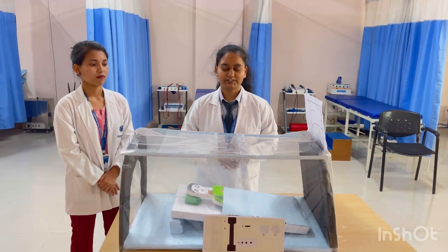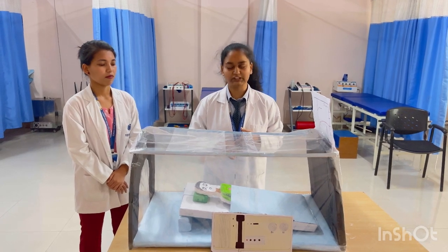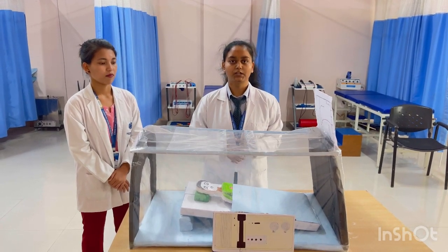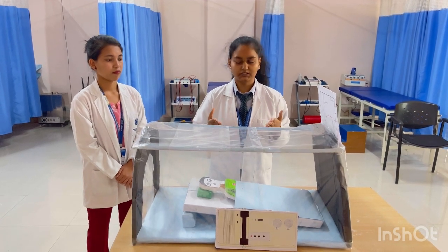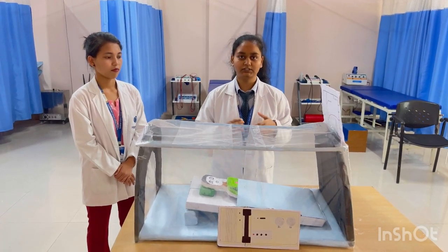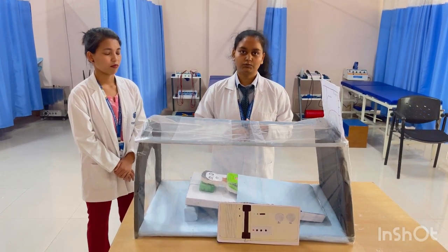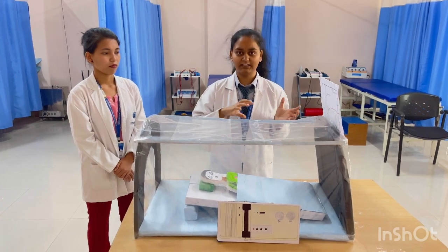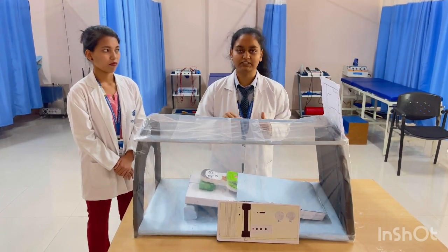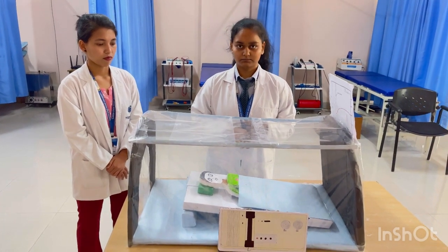We will also do auscultation of the patient to see if the cardiopulmonary situation is good. If it is not good, there will be a risk of some side effects if the patient receives the treatment in poor condition.